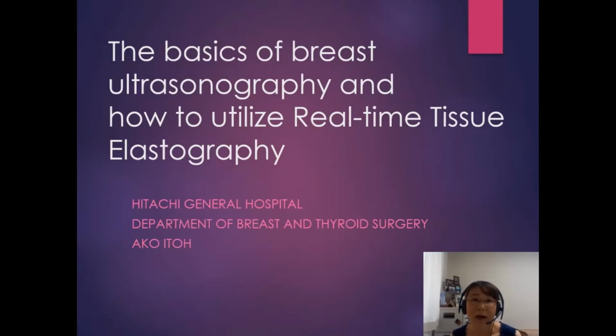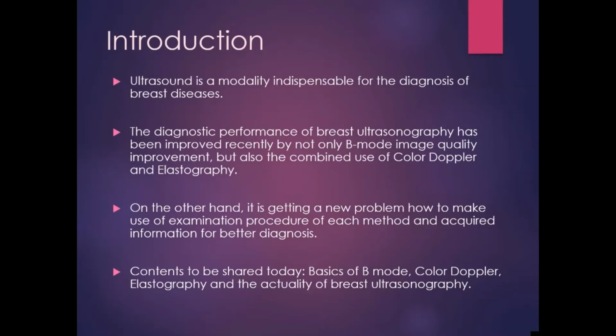I'm Itoh. I'm a breast surgeon of the Hitachi General Hospital in Japan. Today, I'll talk about breast sonography combined with color Doppler and elastography. Ultrasound is a modality indispensable for the diagnosis of breast disease. The diagnostic performance of breast ultrasonography has been improved recently by not only B-mode image quality improvement, but also the combined use of color Doppler and elastography.